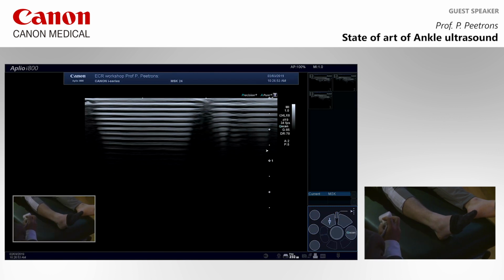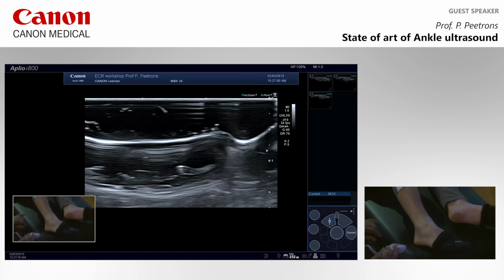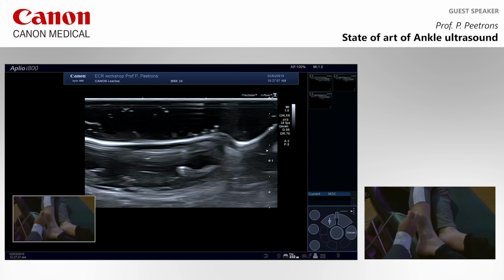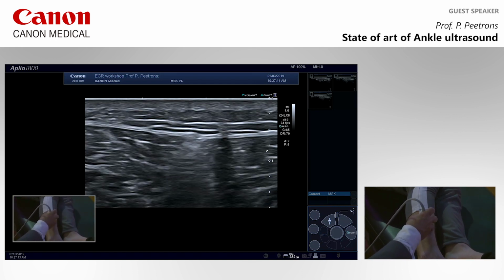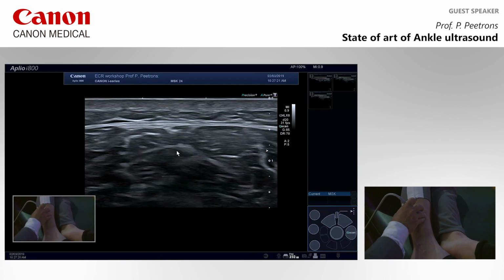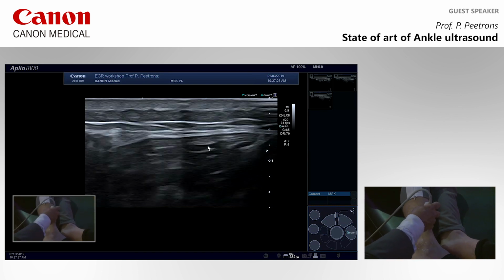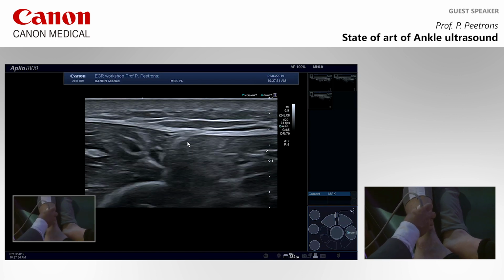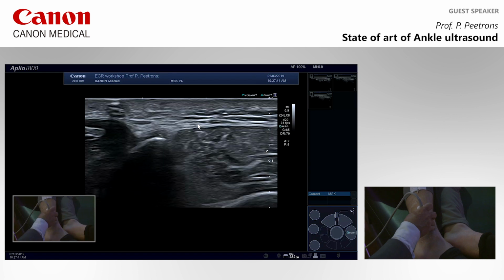So I put my probe 15 centimeters above the malleolus. Can you turn on your left side? Okay, put this here and that one there. Okay, so I put there 15 centimeters from the malleolus. What I'm looking for is the place where the peroneal muscles here, peroneus longus and brevis, that you know, and the extensor muscle, extensor of the toes, are close to each other. And I'm looking just in between. And I see here this little superficial peroneal nerve very easily.